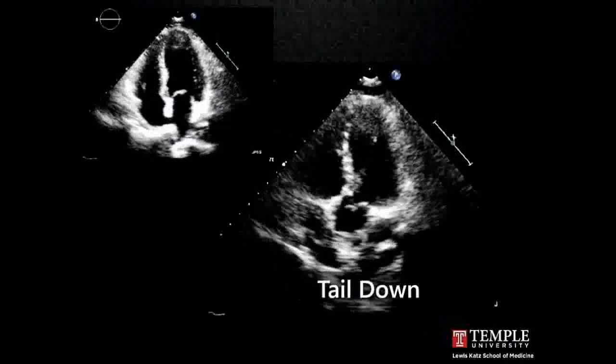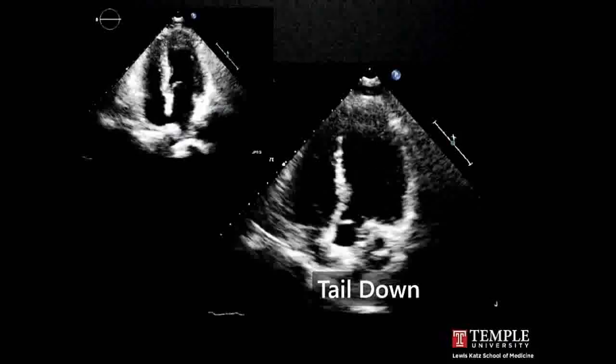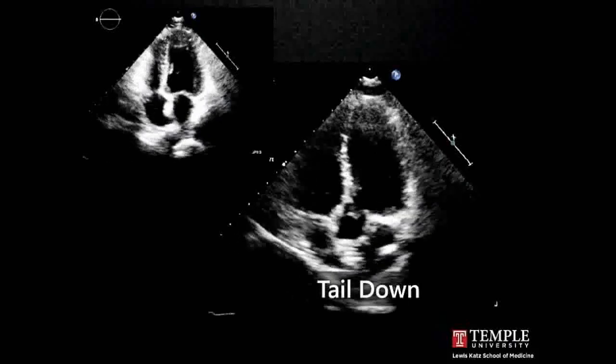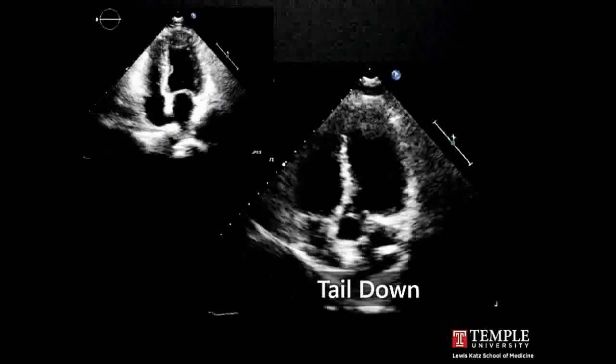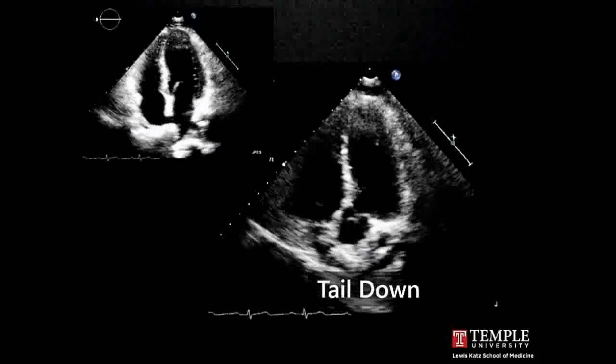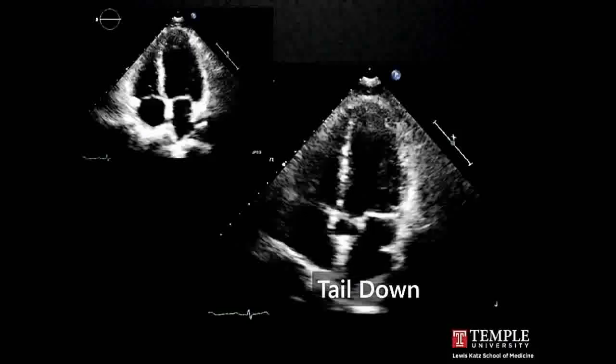And so what can we see within the heart that identifies structures that we would know? Well, you can see the aortic valve. That definitely shouldn't be seen in a four-chamber view. But let's look beyond that. Let's look for other superior structures. How about the Coumadin ridge? Everyone sees the Coumadin ridge there in the left atrium? The left upper pulmonary vein is partially visualized there. The os of the left atrial appendage is even seen. These are high anterolateral structures.